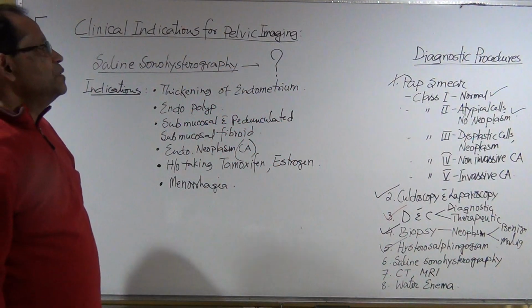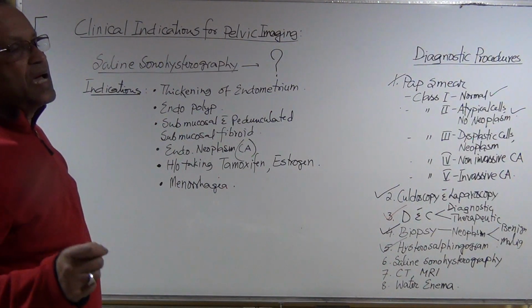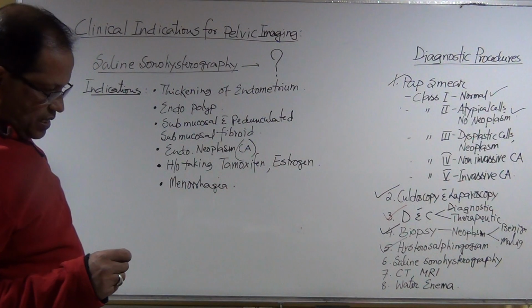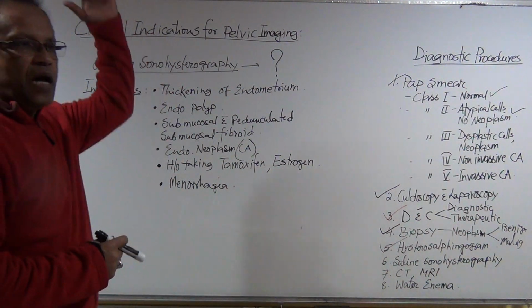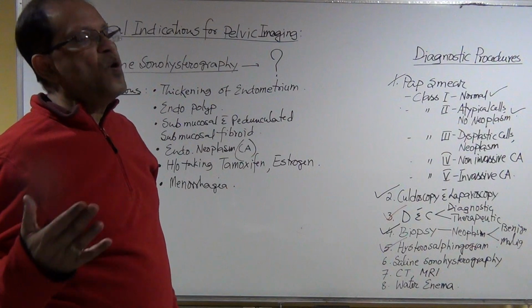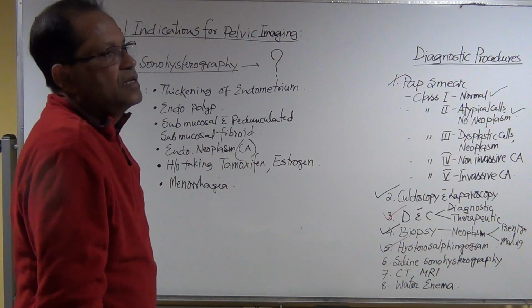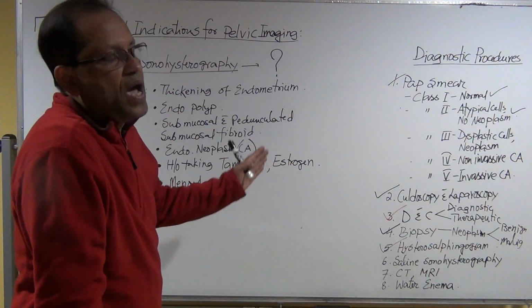Okay, so all those are supposed to be in a sterile condition, and when the evaluation is done, our sonographer will take the picture, image, and at that spot they will find out, yes, we found something, and now we know who is what.